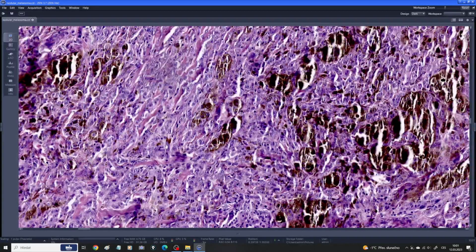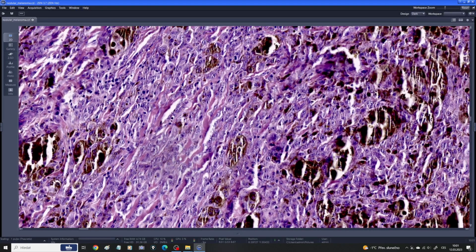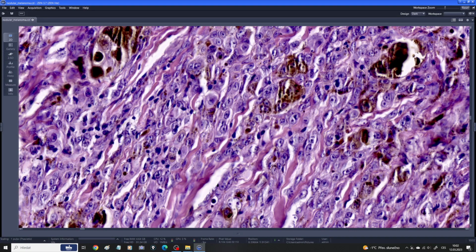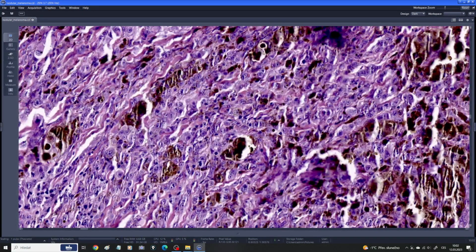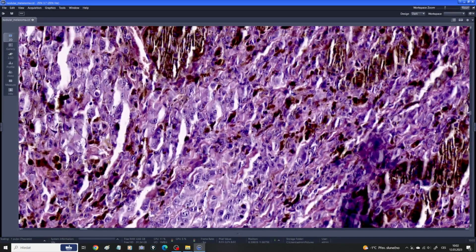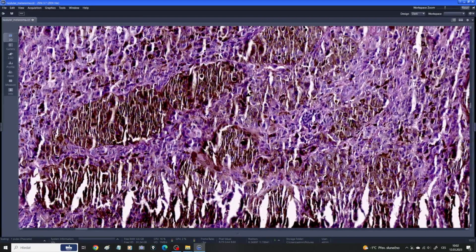clearly see this is a high-grade malignant lesion because it's hypercellular. There is a huge amount of cells, and the cells are highly atypical. They vary in sizes and shapes. There are atypical or even bizarre looking nuclei with prominent, big and atypical nucleoli. And usually there is a brisk mitotic activity. I'm pretty sure we will find some mitosis sooner or later. So this is a clearly high-grade malignant tumor. So this is a nodular melanoma.